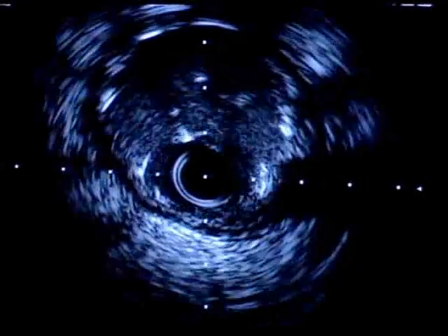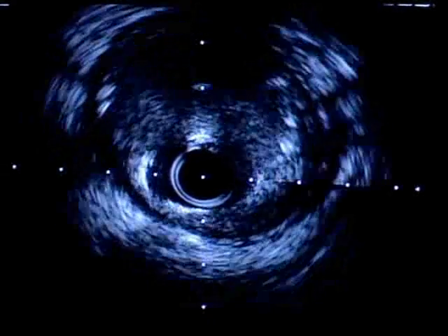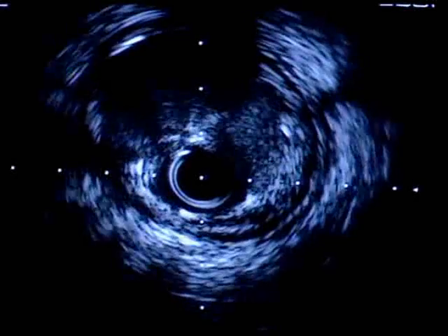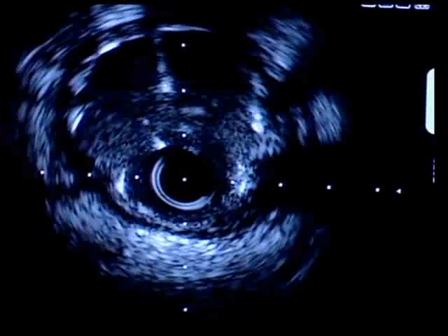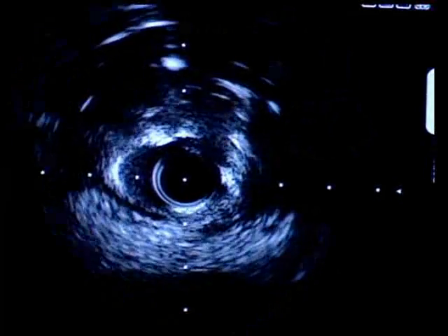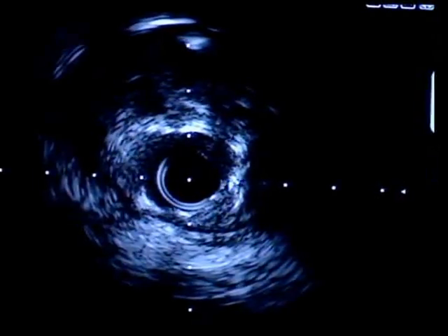But in this particular case, with the IVUS guidance, we are going to go through and just dilate that area of the ostial LAD, which seems to be not expanded completely. So now we'll use the two high-pressure balloons.